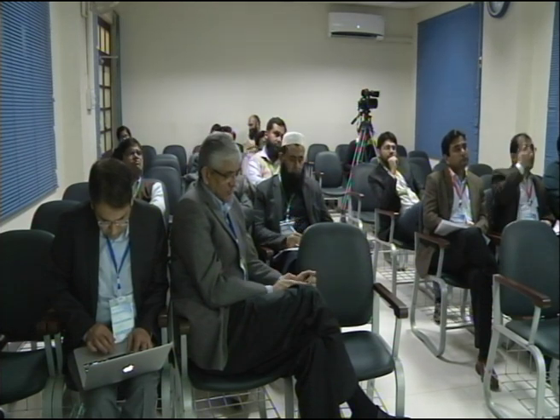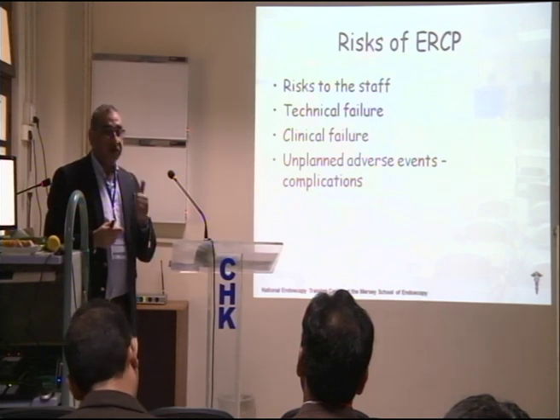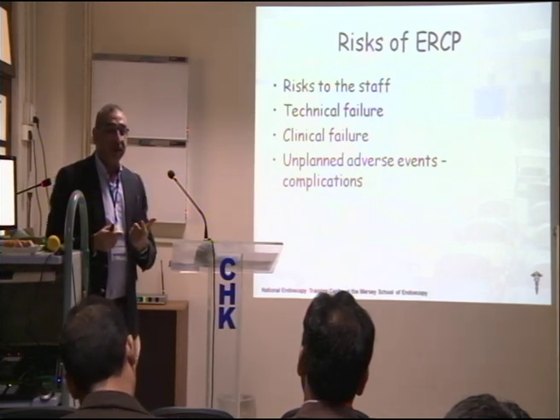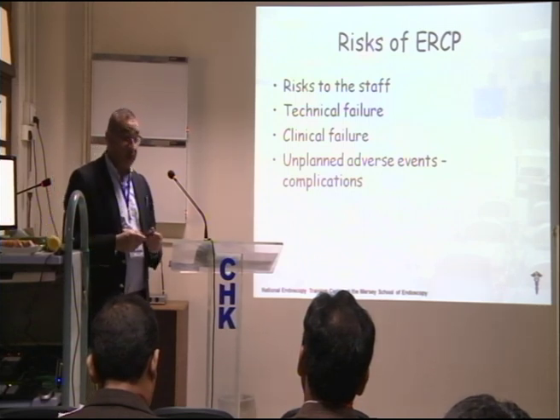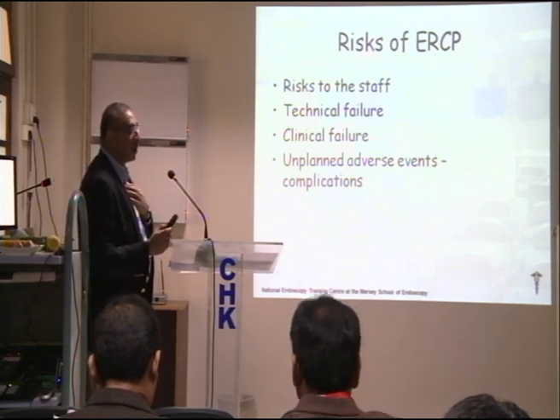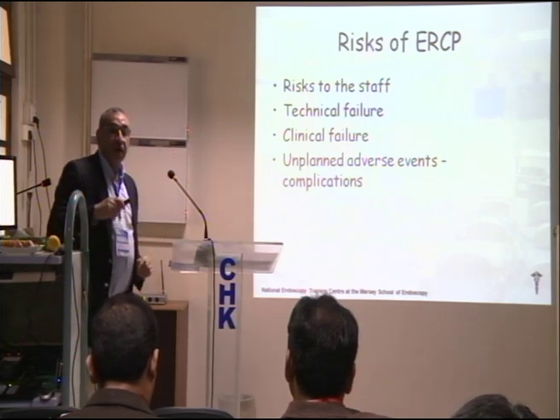Risk of ERCP. Risk to the staff, on which we had a very good lecture from Professor Tariq Mahmood. The main risk is radiation safety, and I think it is very important to be aware of that for your own personal good. Here you are not looking at the patient, you are looking at yourself and your staff, because your staff is your responsibility. You are the captain of the ship. You have to be responsible for their safety as well. It shouldn't be that you wear a lead apron yourself and leave them standing unprotected. So that should not happen.